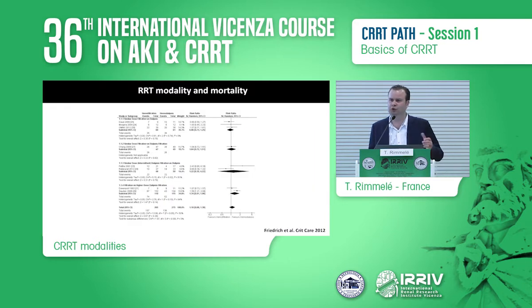So in terms of short-term mortality, there's no difference between intermittent hemodialysis versus CRRT. That was shown several times in the past in the literature. I just displayed here a meta-analysis published a few years ago in Critical Care. No difference between IHD and CRRT in terms of short-term mortality.